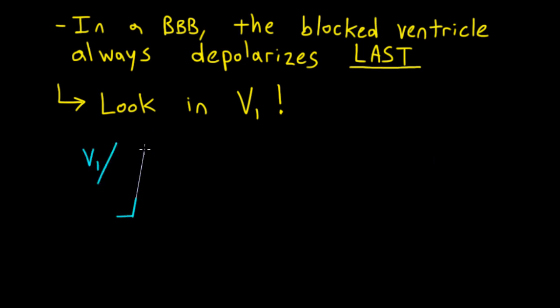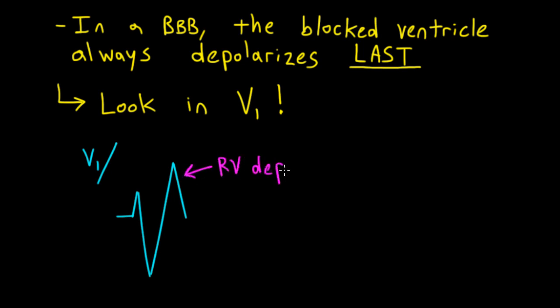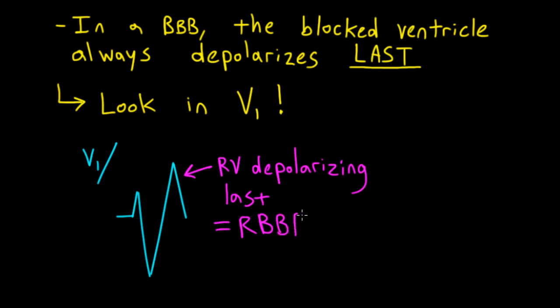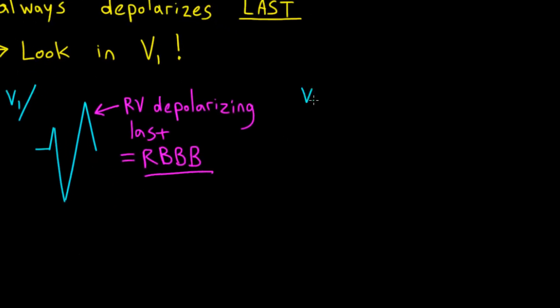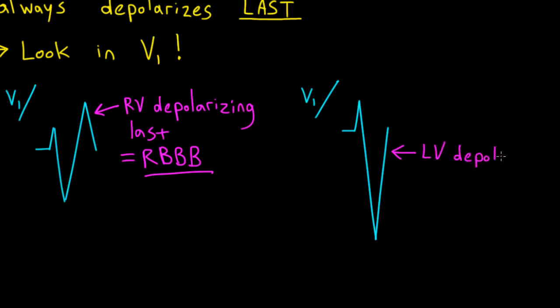Let's look at this wide QRS complex in lead V1. The terminal deflection is positive, so that tells us the right ventricle is depolarizing last — thus the right ventricle is our blocked ventricle, which means we have a right bundle branch block. Now let's look at another wide QRS complex in lead V1. Because the end of the QRS complex is negative, we know that the left ventricle is depolarizing last, which means this is a left bundle branch block.